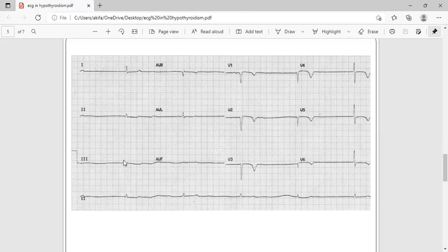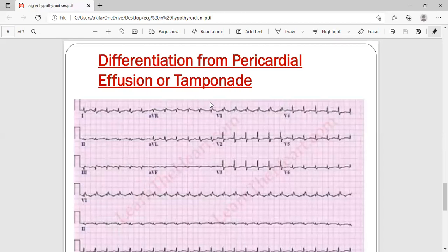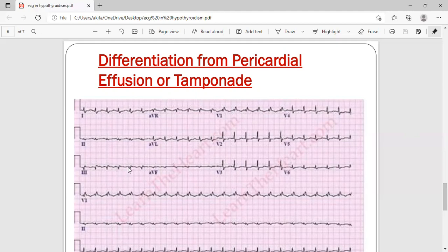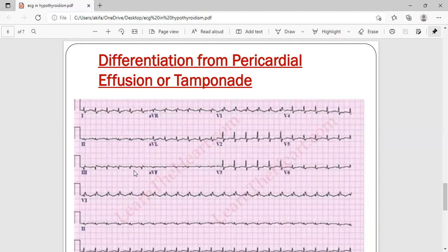One important differential diagnosis for low voltage ECG is pericardial effusion or cardiac tamponade. In an emergency setting, when you see a low voltage ECG, the most common differentials are pericardial effusion and cardiac tamponade. In tamponade or massive pericardial effusion, the heart is compressed by fluid causing low voltage ECG — but the heart compensates by increasing its rate, so you will see low voltage ECG with tachycardia. In hypothyroidism, you will see low voltage ECG with bradycardia. So: low voltage ECG with low heart rate — suspect hypothyroidism; low voltage ECG with high heart rate — suspect tamponade or pericardial effusion.